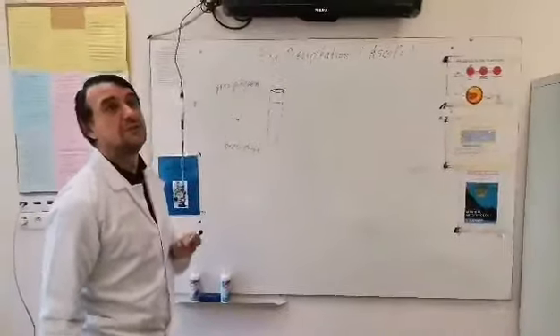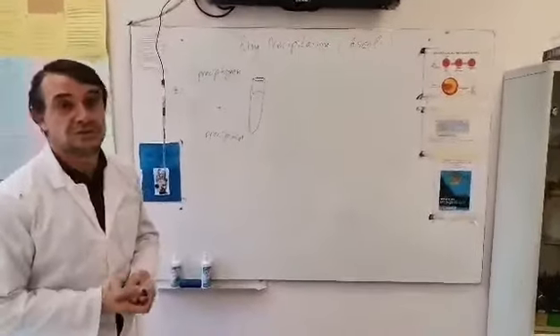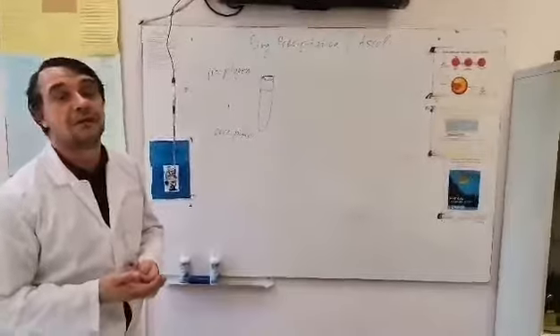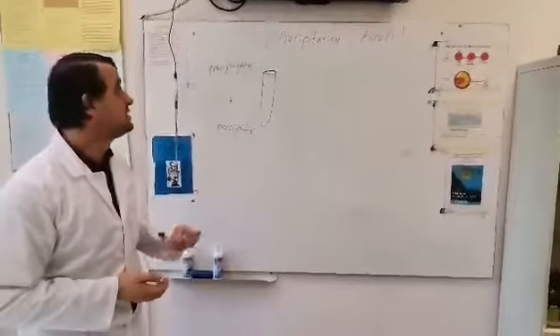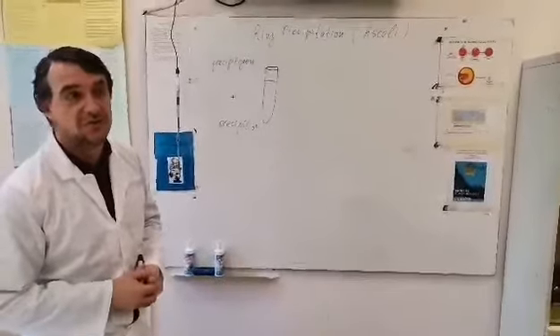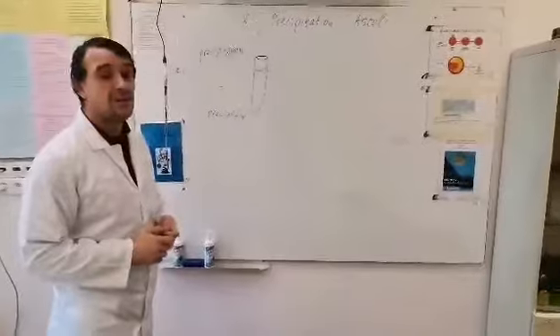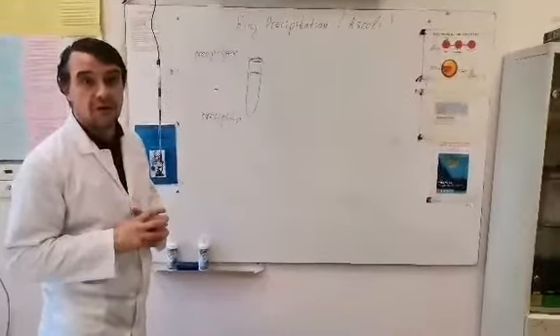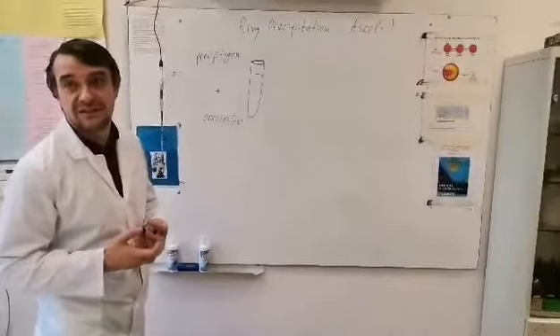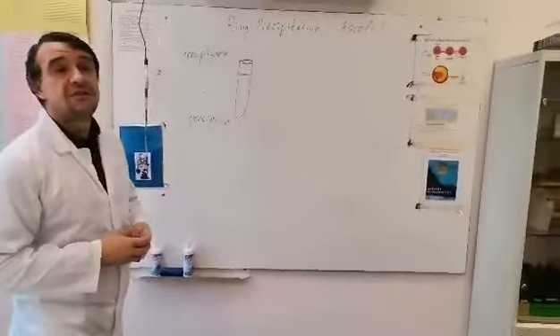in this case called precipitogens, are not a part of a larger structure, so they are not part of the bacterial cell, but they are just some, let's say, protein molecules that are in solution, so soluble molecules. So the antigen-antibody complexes are only molecular complexes without cells inside. Otherwise, it's just the same.